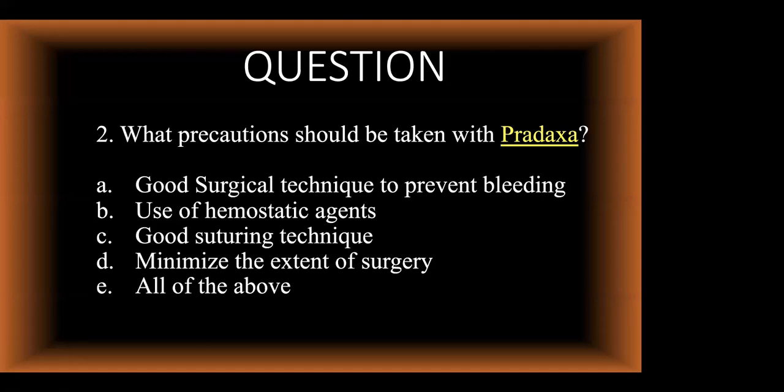So Robert, let's put up the answers here. Please pick A, B, C, D, or E. And the correct answer is, very good, all of the above.